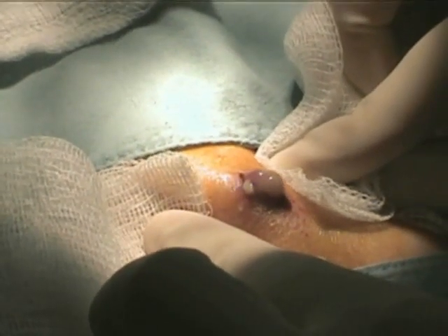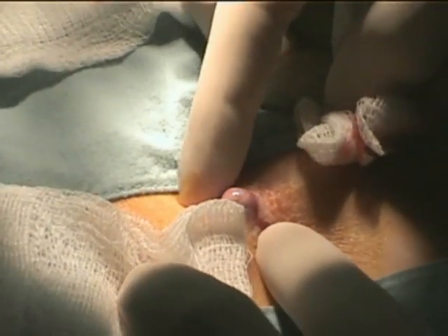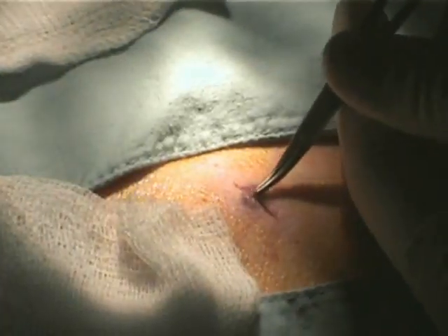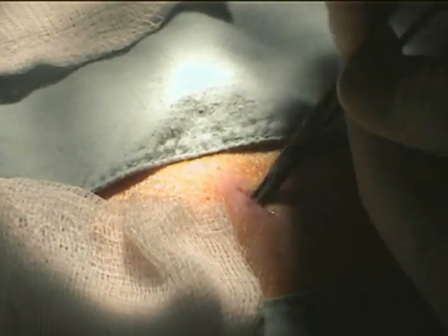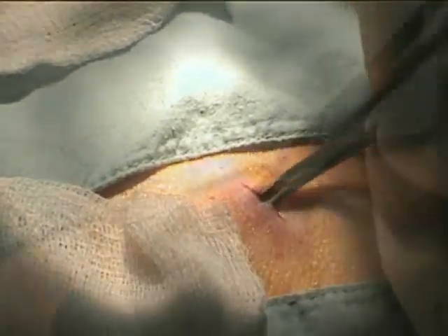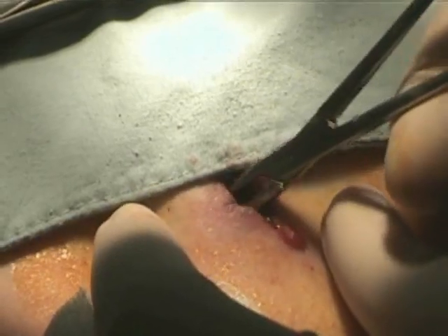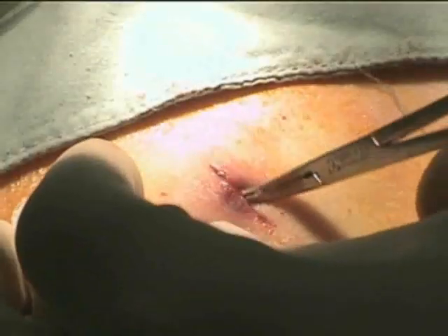Apply general external pressure to express all of the pus. Explore the abscess cavity thoroughly with a sterile cotton-tipped applicator or with hemostats. Attempts should be made to break down any walled-off pockets or possible septa.